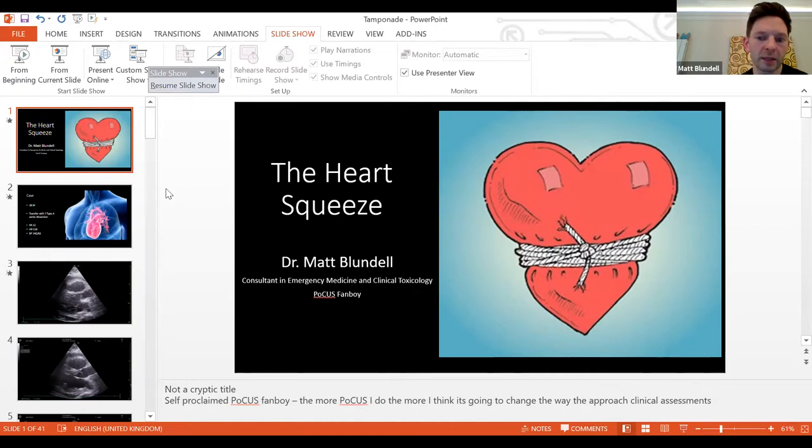As with vascular access, you're getting the area under the middle of the probe and measuring how deep it is. You can see the centimeter markers on the side, and then with live ultrasound viewing you can see the needle going into the pericardial space. If you see a patient with a pericardial effusion next time, just roll them around and see where you would want to do the pericardiocentesis. You'll often find it's the apical four chamber view, or even the parasternal long axis. It's very rarely the subcostal view, which is what we're always taught by the landmark technique, which is a bit crazy.